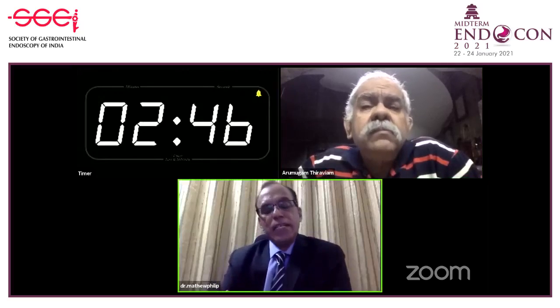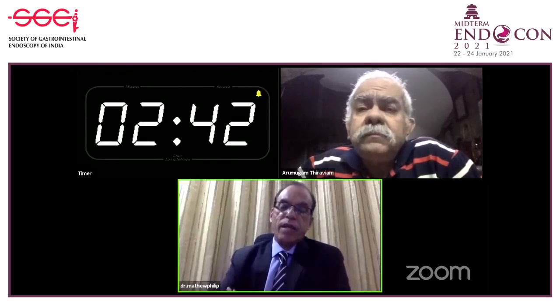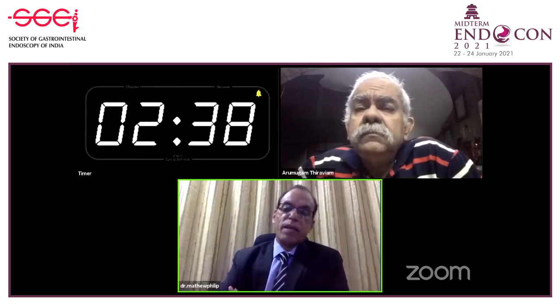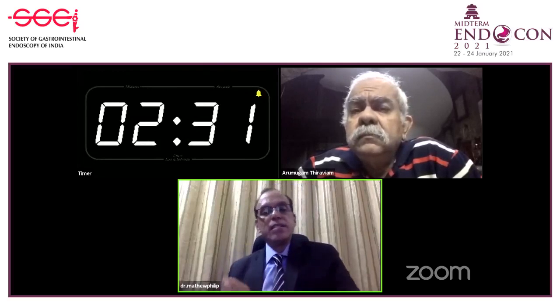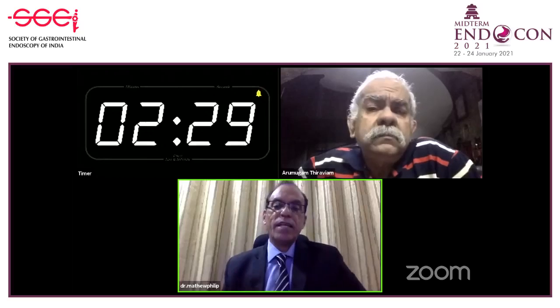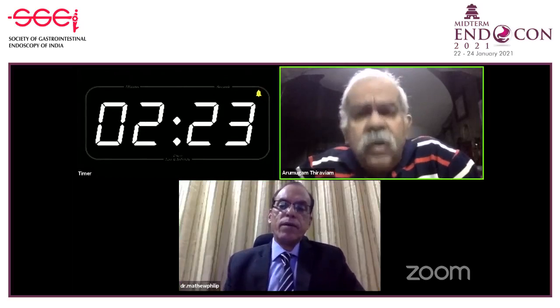I will not say that because, in the beginning, yes, of course, it takes a lot of time because the 290 system scope has got a different light system. So it actually takes a little time for orientation of that. And also the assistant support for spraying the dye and looking at that and washing and cleaning the mucus. It takes some time. The chromoendoscopy, sorry.